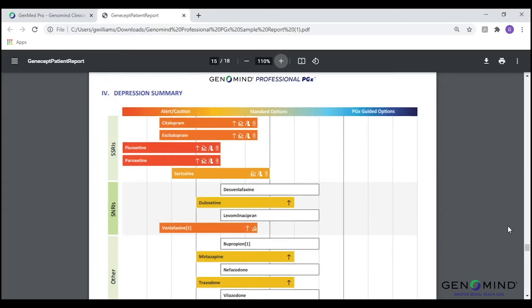The next page of our report is the diagnosis-specific summary. Think of this as your at-a-glance page. This page provides a graphical depiction of medications indicated for specific disease states, with medications and treatments being shifted on the plot based on a patient's genetic interactions. These summary pages are currently available for depression, anxiety, bipolar disorder, ADHD, and pain management.